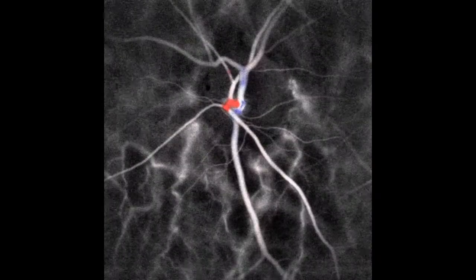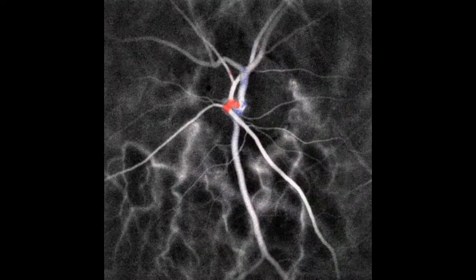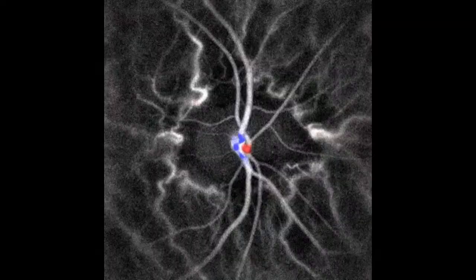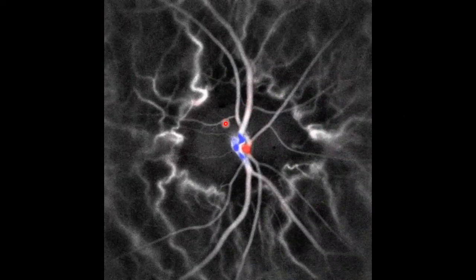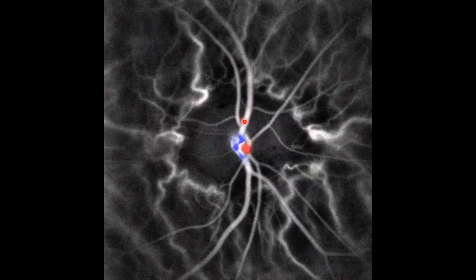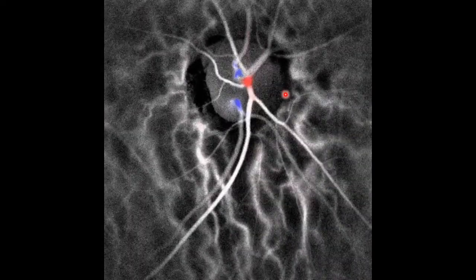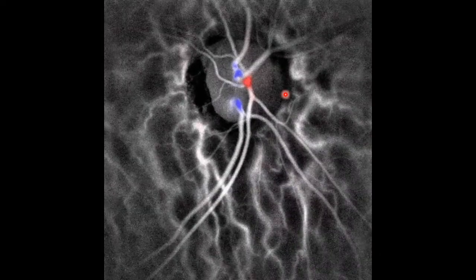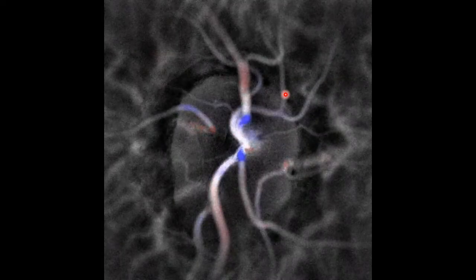So you can see in red the central retinal artery, and in blue the vein, and other areas where the vessels have a particular inclination. Now, what's interesting to note is that, first, in these examples the directional blood flow contrast remains the same in the artery and the vein. It preserves the same color, which means that the flow is going in the same direction throughout cardiac cycles.